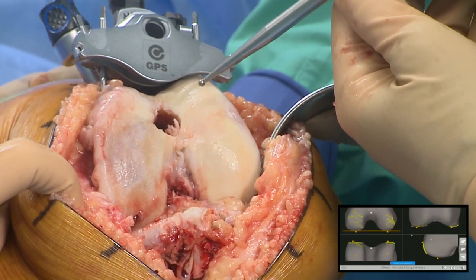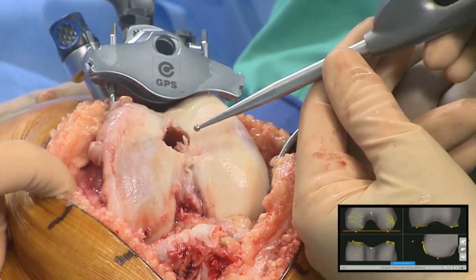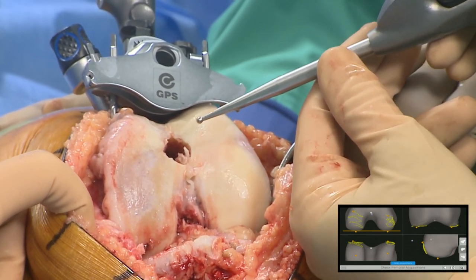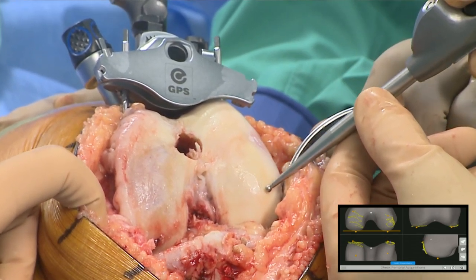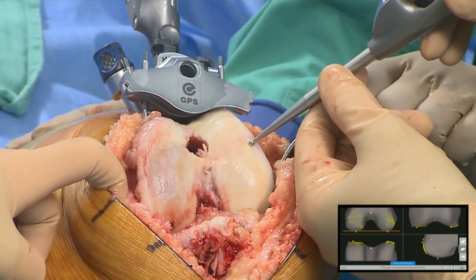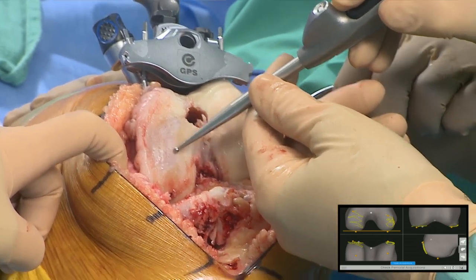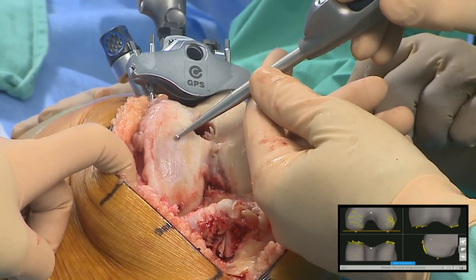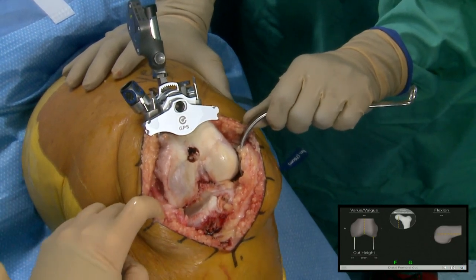On the navigation screen — the GPS screen that you can touch and interact with — you can see I'm going over the bone with the probe, making sure what I see on the screen matches what I see on the patient. Now in the validation screen, we see essentially what we're planning on cutting. We put a cut checker into the slot and we're pretty close to what we want — about one degree of mechanical varus and three degrees of flexion. I usually aim for four.